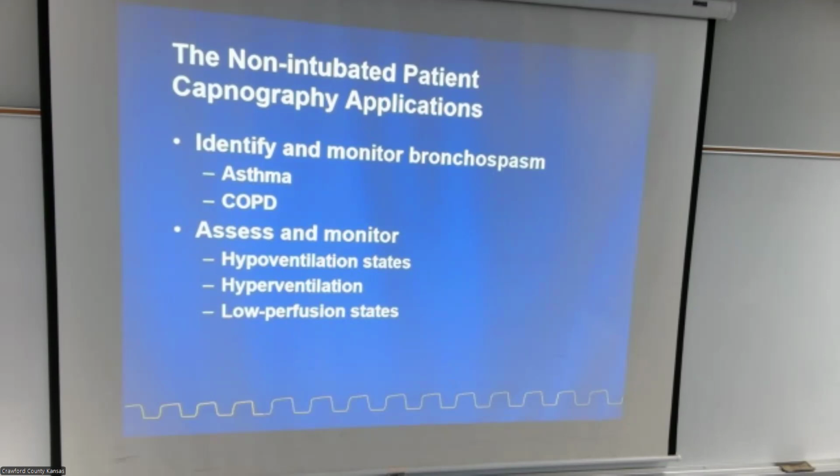So we're going to differentiate bronchospasm, asthma, and COPD on the monitor. What's it going to look like on the monitor? Shark fin. We're going to assess the monitor for hypoventilation states, hyperventilation, or low perfusion states. So what's our hyperventilation state going to look like? Hyper. There you go. And hypo. There we go.